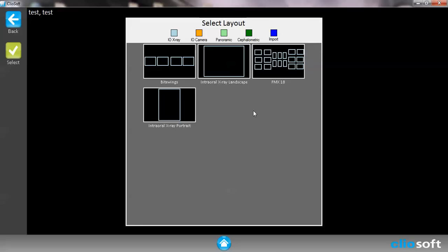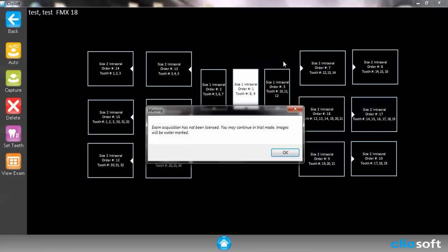So for this case the two most common layouts that are used are the ByteWing and then the FMX. So let's go ahead and go to FMX.